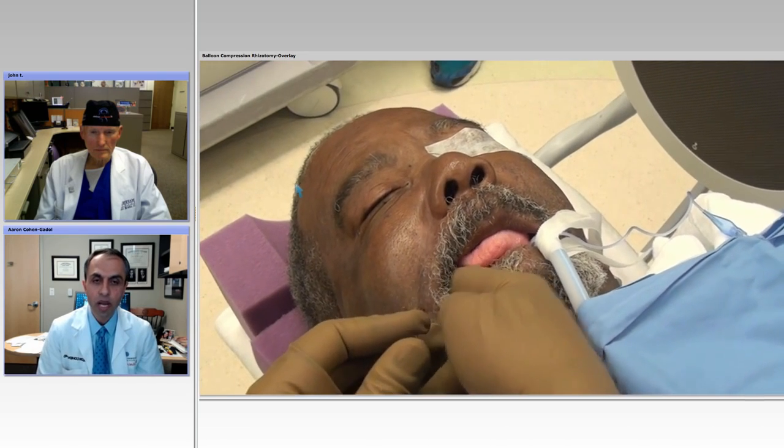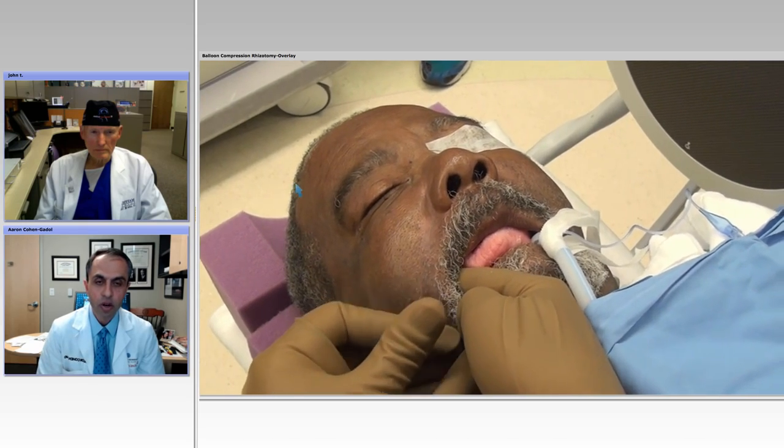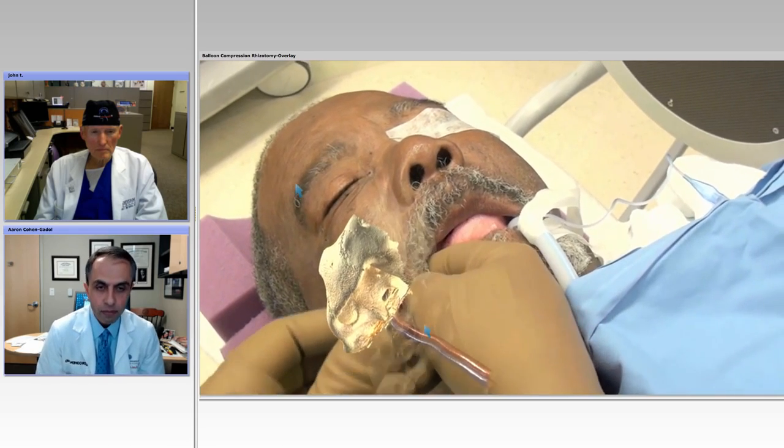You're going to see momentarily, we're going to have an overlay view of the skull, which will give us an idea where things are here. Again, passing the pterygoid. And here's the view of a surgeon if you have a skull. We wish every patient had this sort of view with their skull overlaid on their head. And you can see for a surgeon how the angle is. It's again medial canthus, just like you mentioned, and it's 3 centimeters anterior to the ear. And that's the view, so you want to have that in mind as you're advancing your needle.